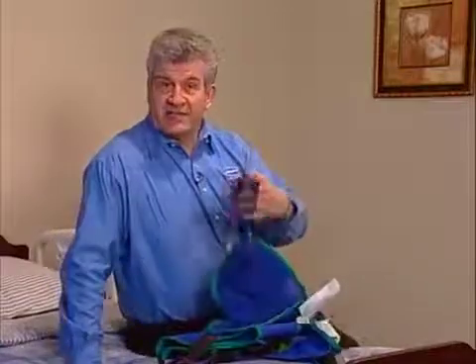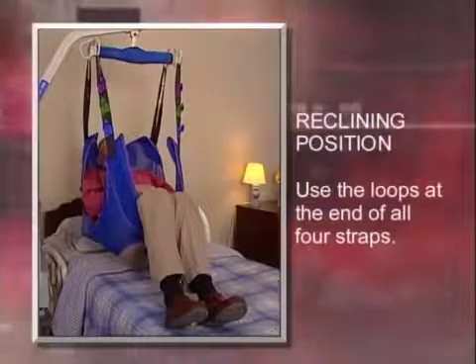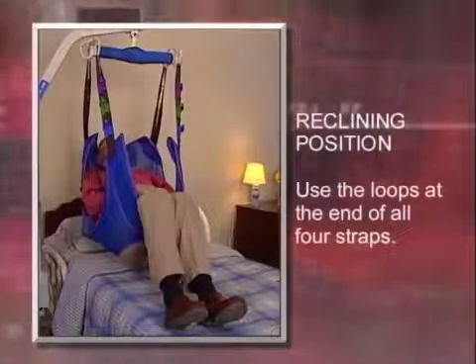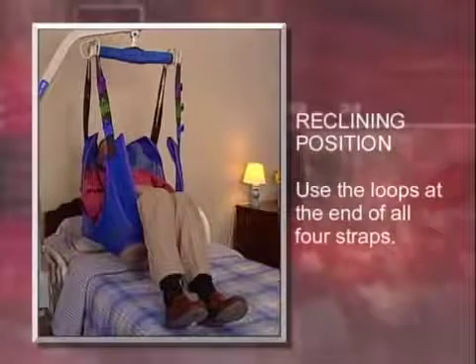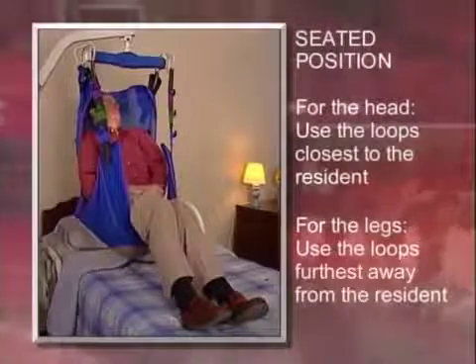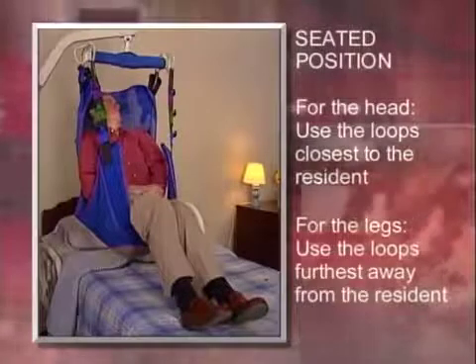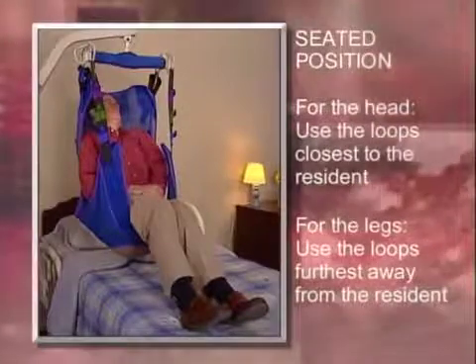You can adjust the slings for different body positions by using different combinations of color-coded loops that are sewn into each strap. If you want to position the resident in a reclining position, attach the sling using the loops at the end of all 4 straps. If you want to position the resident in a seated position for the head, use the loops closest to the resident. And for the legs, use the loops furthest away from the resident.